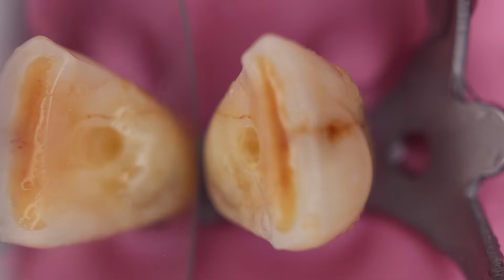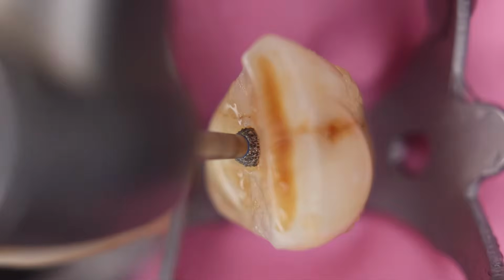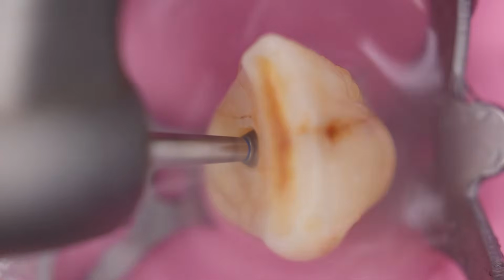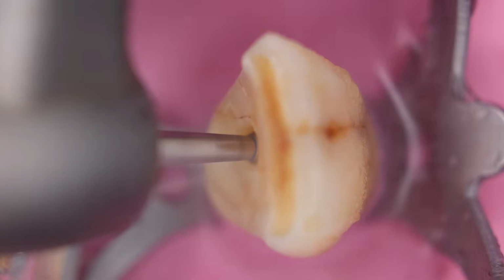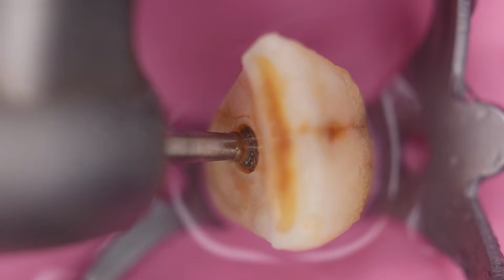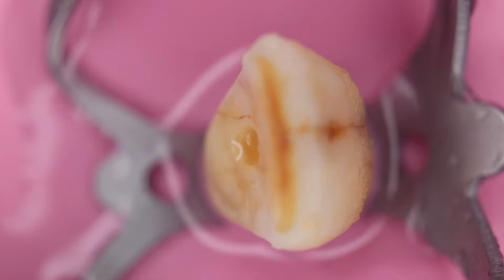Hope you can appreciate now. We are at 45-degree angulation like this, and half of the burr has entered. Now this must be sufficient. When roughly the full burr has entered, as you can see over here, now you need to change the angulation. So let us evaluate further how you see it.